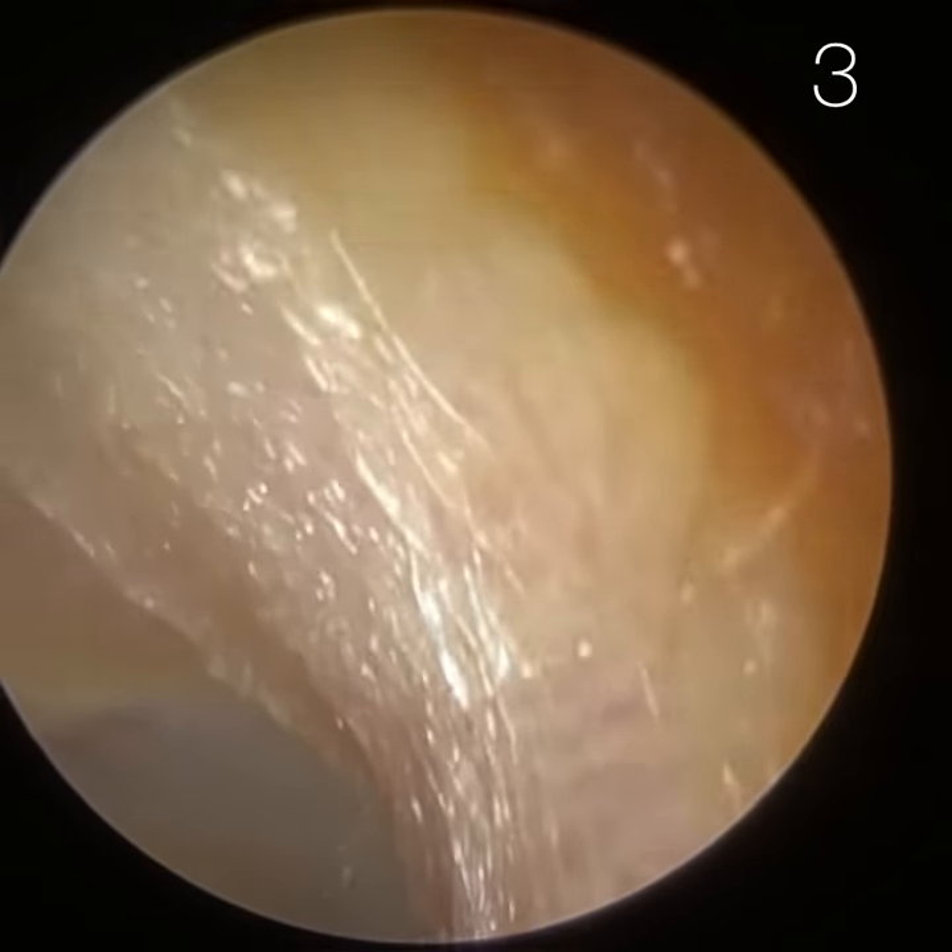This eardrum doesn't look retracted. You may have seen at the eardrum this white perimeter — we call that the annulus. In this patient it runs between roughly two o'clock and ten or eleven o'clock. The annulus is what stretches the eardrum, and it's made up of fibrocartilage.